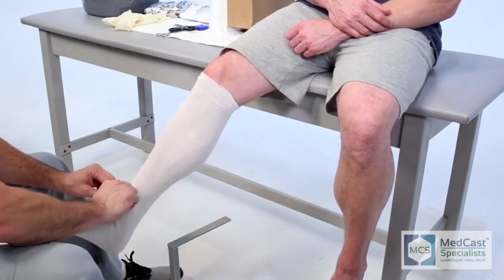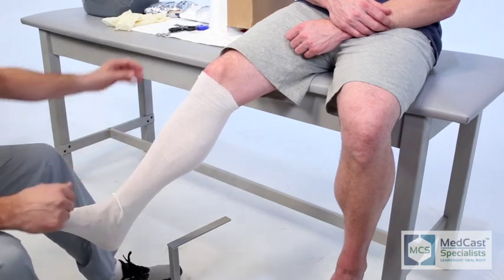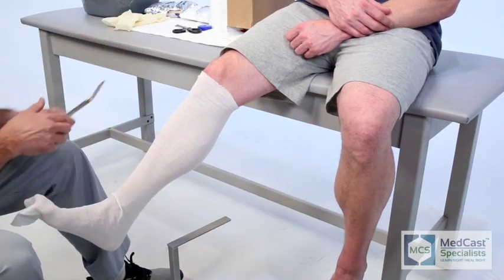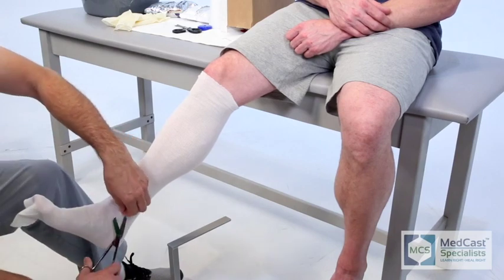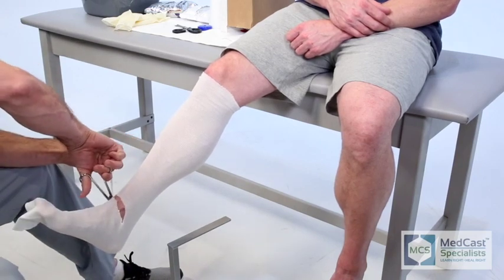Always smooth it out and put a little TLC into your application of the stockinette, because you don't want any underlying wrinkles that may irritate the patient. You don't want to have them complaining about this — they have to wear it sometimes up to four to six weeks. So be cautious.